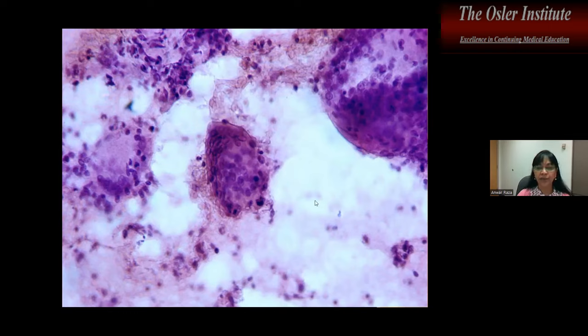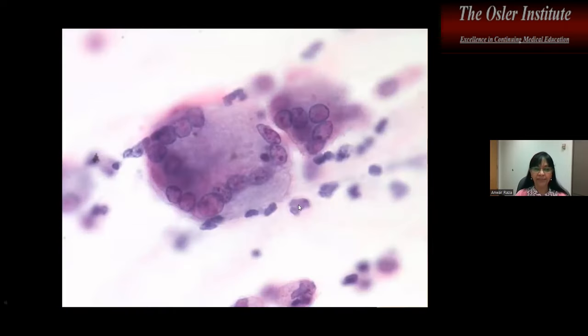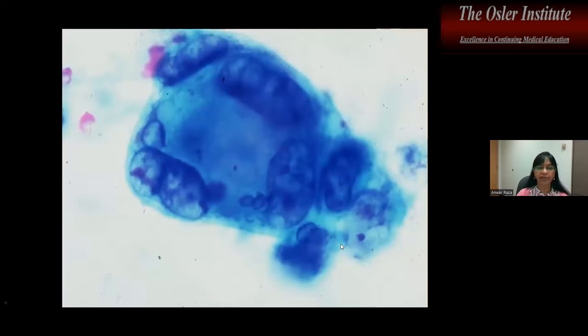If I told you this was from the thyroid aspirate, the patient has recent upper respiratory infection, tenderness, and you aspirated it, and you see this, this would be that de Quervain thyroiditis, right? The one that's associated with viral infection. So here's a giant cell. Here's another multinucleated giant cell, and these can be seen, for example, in granulomatous infections, granulomatous diseases, sarcoidosis, could be with mycobacterial infections as well, right? So multinucleated giant cell there.